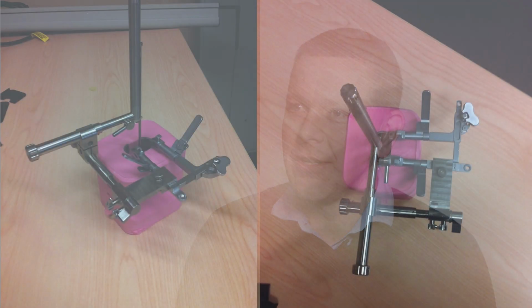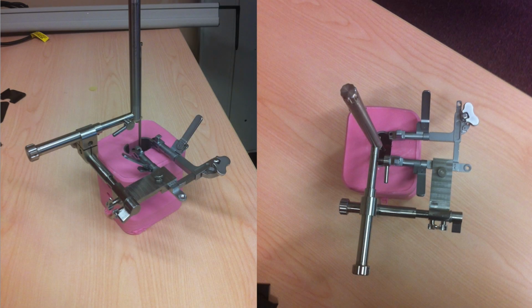Our involvement in that project was from very early stage, trying to conceptualize what and how the device was going to function and deliver stem cells to the targeted region. It involved some early stage design, development, workflow development, early stage prototypes that were used in preclinical porcine studies to try to determine how and what is working and what is not.